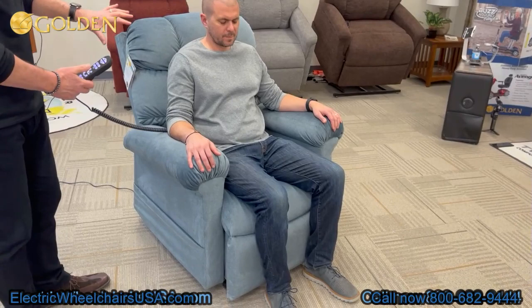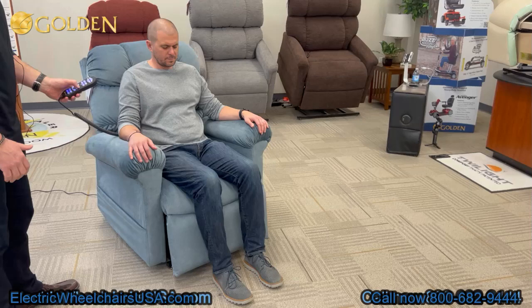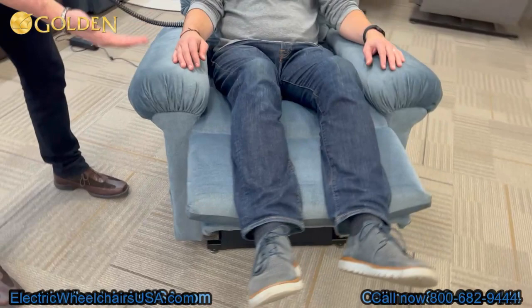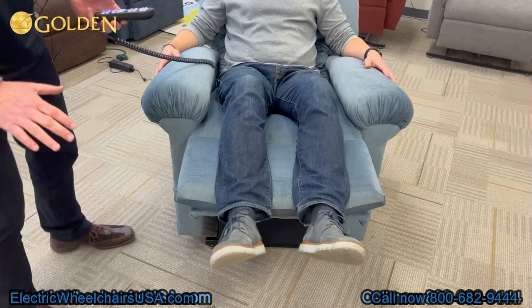This chair has a traditional back which we refer to as a biscuit back — each little square looks like biscuits, with buttons for a more traditional look. I'm going to raise the feet using the arrow up button. You can see when his feet are rising, the seat box is sliding back between the arms and then rising up, which puts a bit of a bend in the knee.